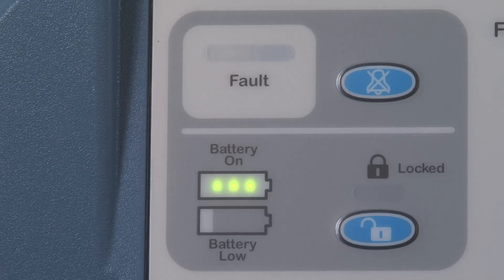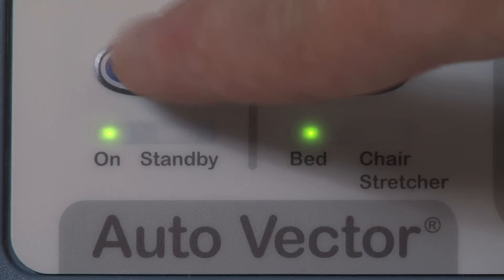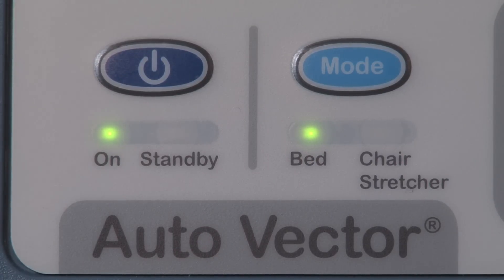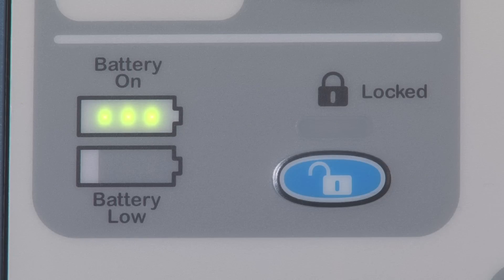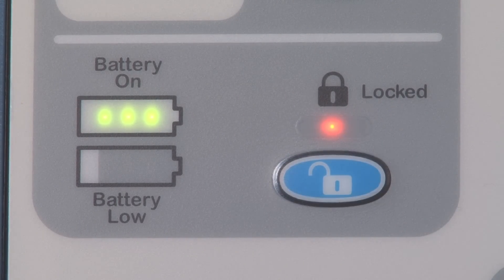The leak alarm will alert you if the mattress has a leak and requires service or replacement. The fault indicator will illuminate in the rare instance that the microprocessors need to be reset. To reset the microprocessors, simply press the power button to engage standby mode and press the power button again to turn the system back on. The lock button will lock out all controls when engaged, helping to prevent accidental or unwanted changes to the therapy settings. To unlock, simply press the button again.